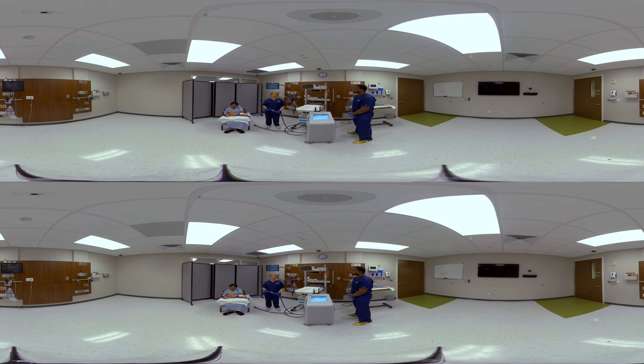When it's time to stop therapy and disconnect the pads from the fluid delivery line, you'll first want to click stop on the screen. You will be prompted to click start in order to return the water from the pads back to the device. This process takes about 45 seconds to return all the water from the pads back to the device. Once the screen disappears, then you know you can safely disconnect the pads without any water leaking out.